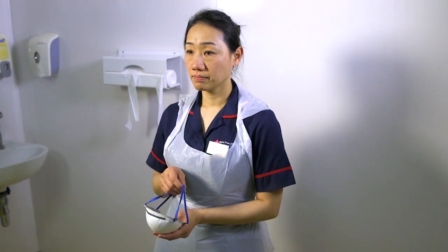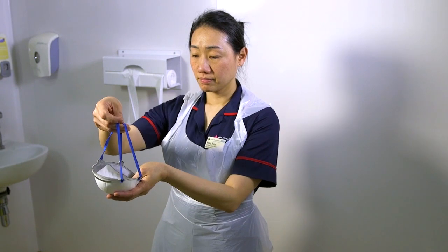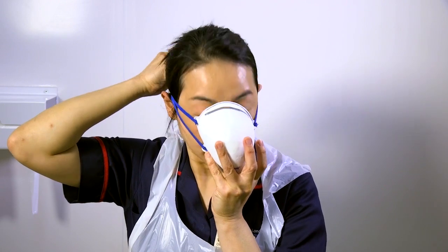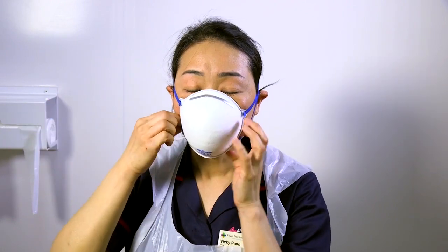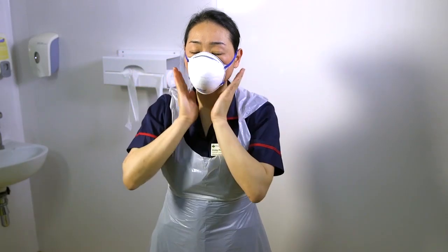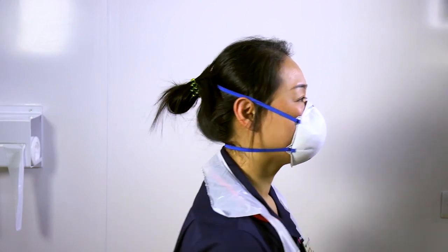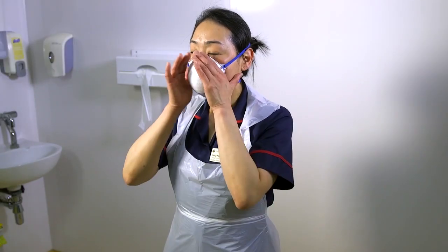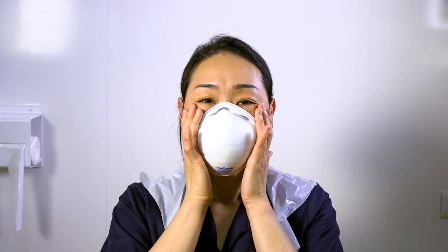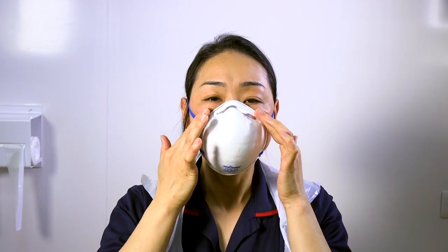To put on your respirator mask, hold the mask with one hand and the strings with your second hand. Place the mask over your nose and mouth and take the strings to the back of your head. Position the strings so that they hold the mask tightly to your face. To ensure a good fit around the face, bend the metal strap at the top of the mask to fit securely around the nose.